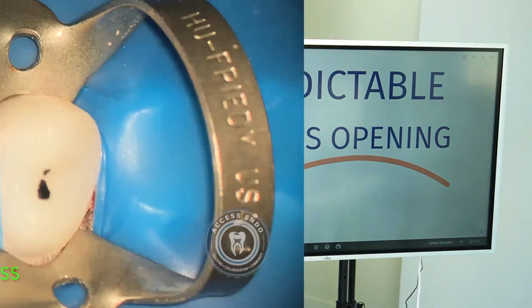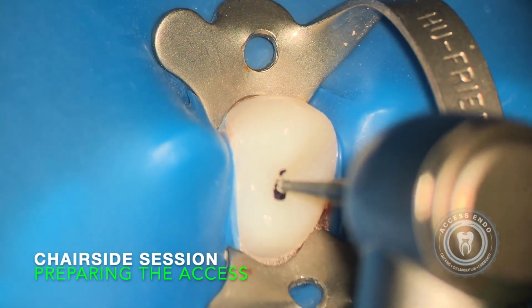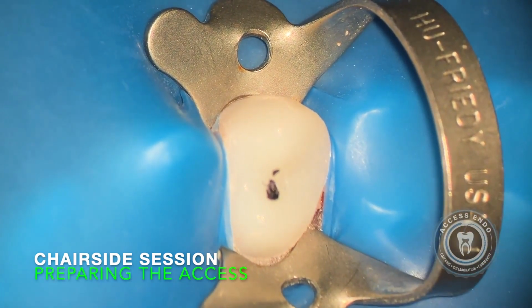Let's check it out. Okay, so we're going to bring our burr in, again always being mindful of the long axis. You can see I've got my Sharpie mark. You can see the number 2 round is nice and small, so I can just make my initial penetration into the enamel and dentin.